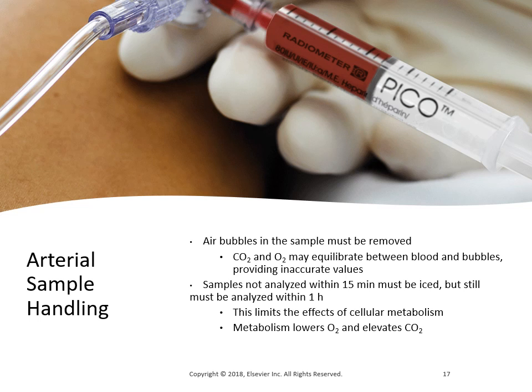When using a point-of-care analyzer, the instrument needs to be properly prepared before obtaining the blood gas sample. Normally, this involves verifying its power-up operation, inserting the needed cartridge, and confirming the internal calibration. After the sample is obtained and any air bubbles are removed, it should be thoroughly mixed and injected into the cartridge within 2 to 3 minutes, depending on the manufacturer, and the sample should not be placed on ice.